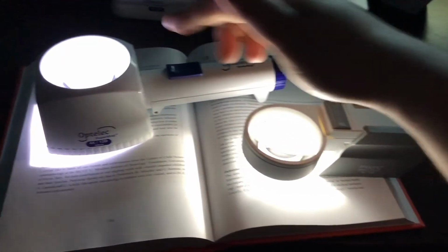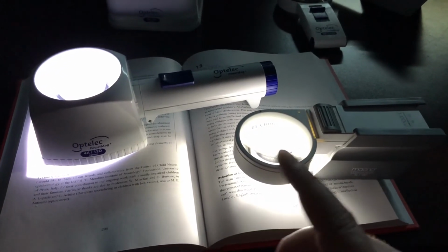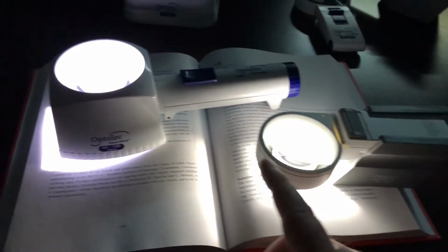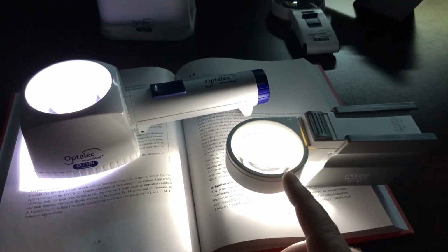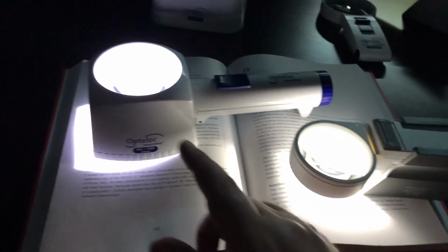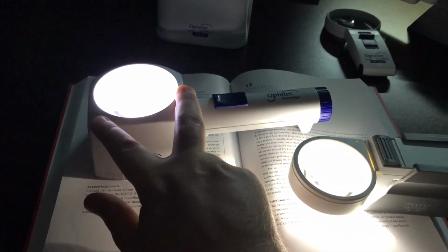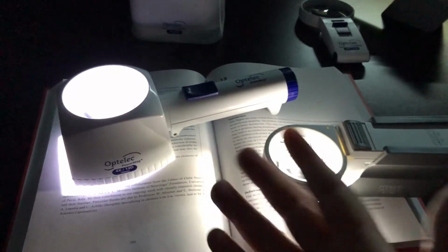So clarity through the lens, both of them read very well. The Magno has a better quality lens in it than the Optelec, and it also has a greater degree of magnification because this is 16 diopters versus 12 diopters. But the lens is larger on the 4x Optelec. However, is it a true 4x? That could be argued.